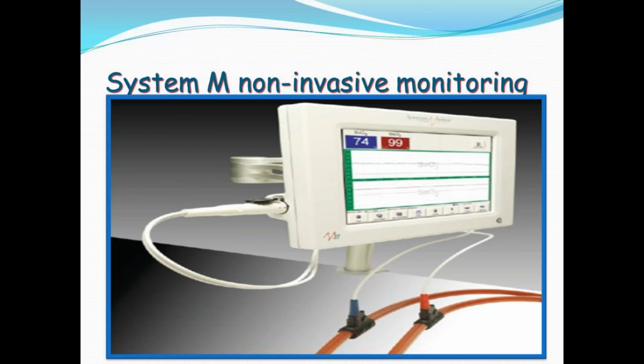The flow sensor is separate and can be attached anywhere in the circuit. Only thing, in my case it has been attached to the pump itself. The problem with that is, suppose we have a VAV ECMO. In that case, we find it difficult to measure how much flow is going to the artery and how much is going to the vein, because it will measure only the flow which is going out of the pump. So that is a disadvantage of that.